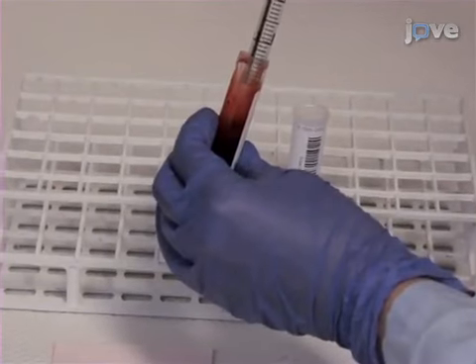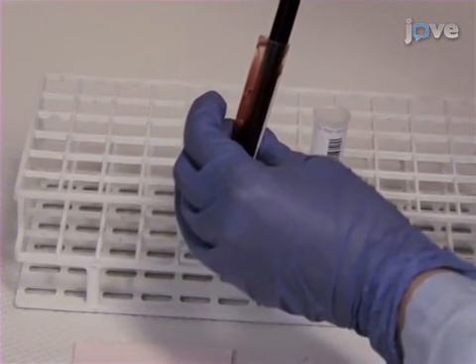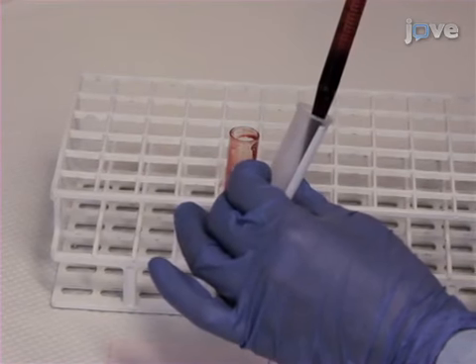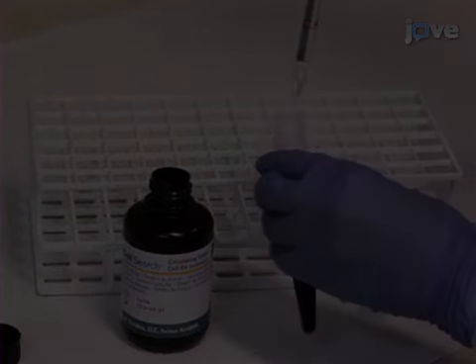Collect 7.5 milliliters of the blood sample from a CTC preservative tube and slowly dispense it into a processing tube. Add 6.5 milliliters of dilute.